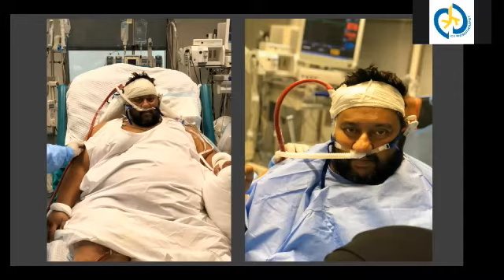So when we compare, ECMO helps us to progress in mobility because the patient is on a machine that can control the gas exchange. If there's any problem in a patient without ECMO, I cannot do anything to ask the lung to give me more oxygen because the lung is bad. But with ECMO, we can play with the ECMO parameters to let them be fit for exercising.